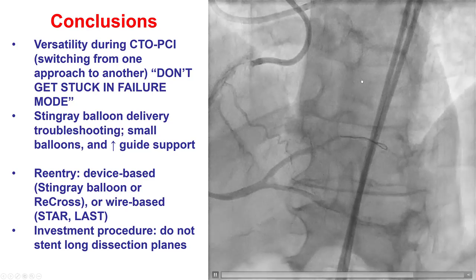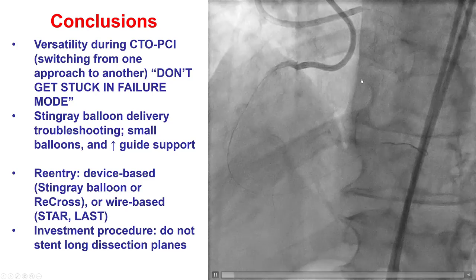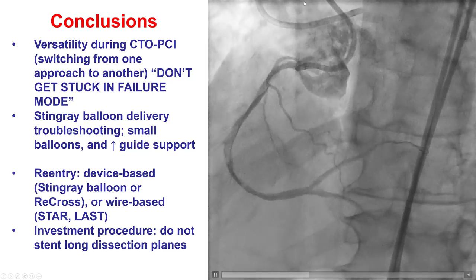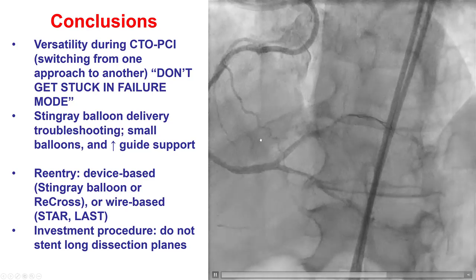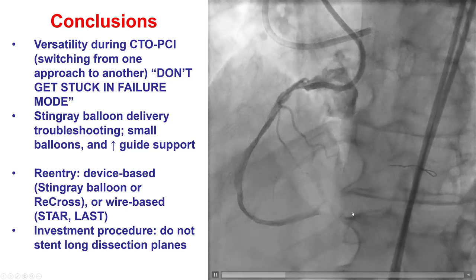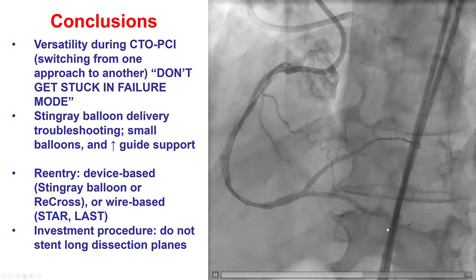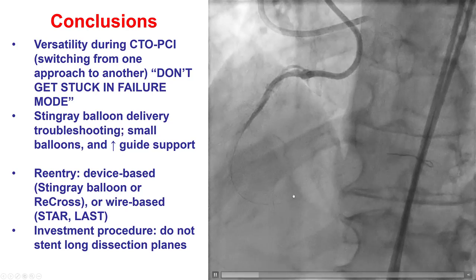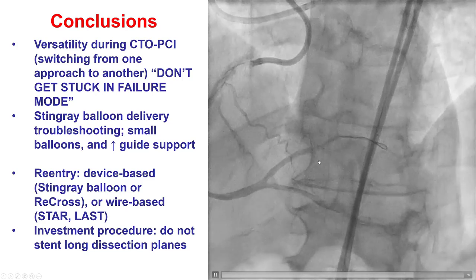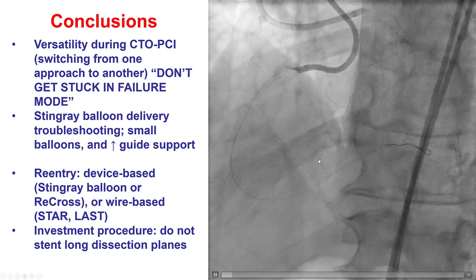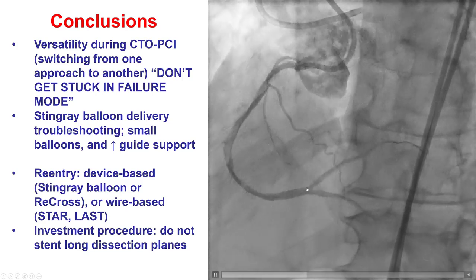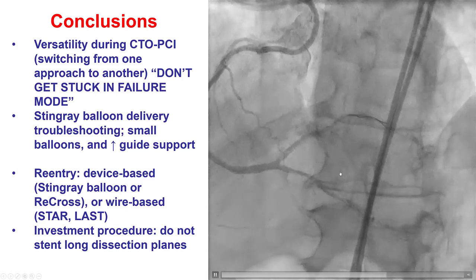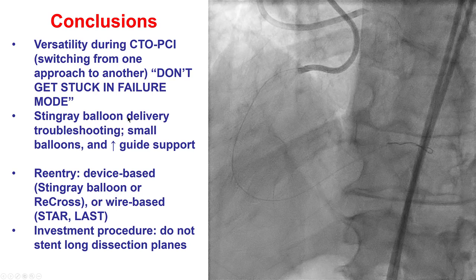This is the final result. We were able to restore antegrade flow in both the posterolateral as well as the right posterior descending artery. However, because we had multiple dissection planes and were uncertain about the point of re-entry, we did not place any stents. This is an example of an investment procedure.